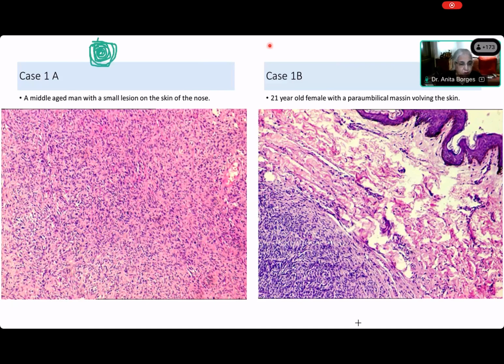Very good. So now, you agree that this is spindle, right? You agree, Saida, that it is spindle? Yes, ma'am. Very good. It is spindle. The other one is also spindle. But we have seen the patterns of spindle cells. I showed you all the patterns of spindle cells. So now you tell me, which pattern of spindle cells does this match? So you want me to shout all the patterns one by one?